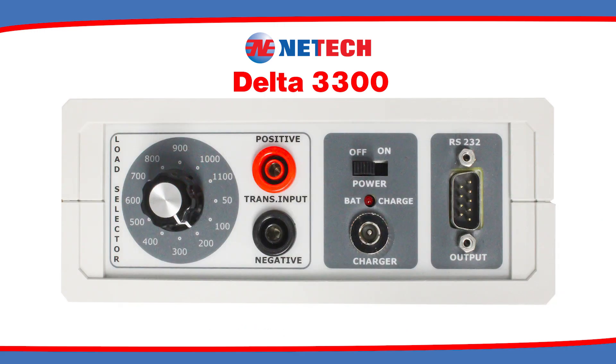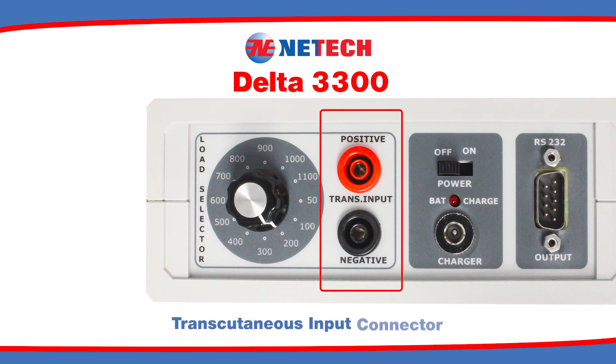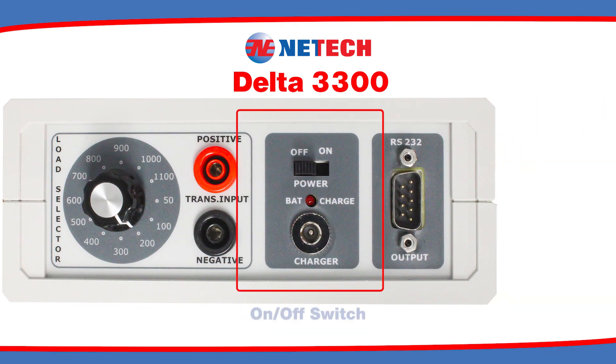On the right side of the unit, there is a D-sub-9 connector to establish connection with a PC for uploading test data using the supplied RS-232 interface cable. The transcutaneous Pacer input connections, as well as the Pacer input load selector, are also featured for ease of use. The on-off switch and the battery charger input are also located here.